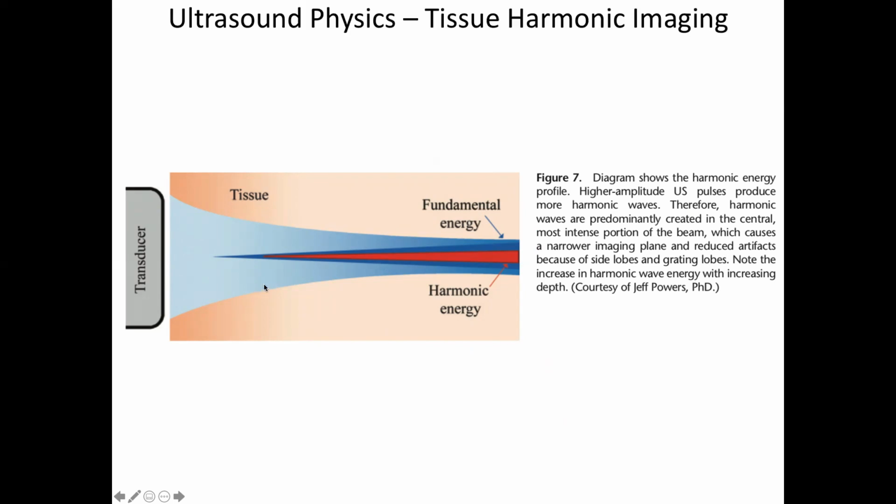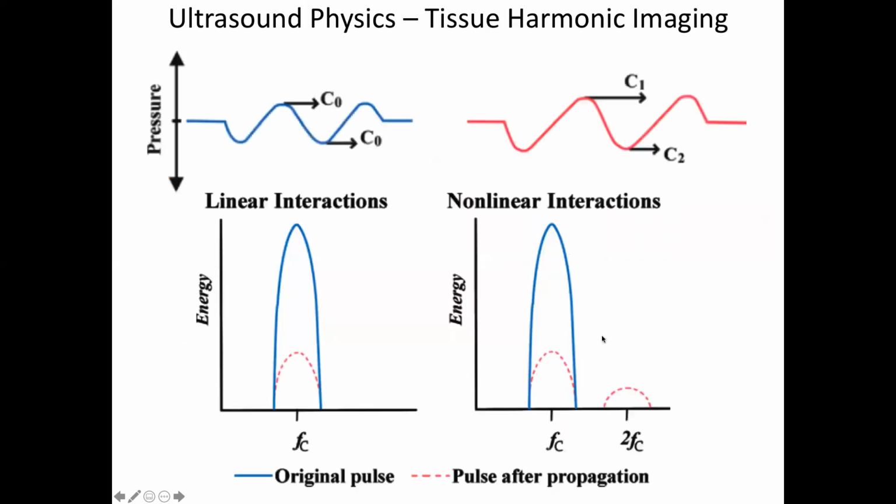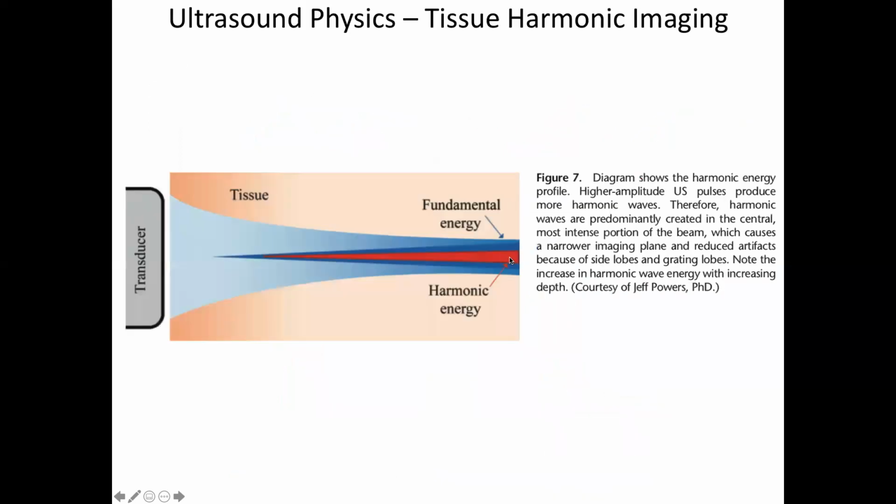And so this is going to help us in two ways, right? It's going to help us focus the beam at depth, and it's going to help the slice thickness become thinner at depth. If we just look at this signal, we know it's coming from this part of the sample and not out here. And so in both the lateral resolution and the slice direction, the whole thing is going to collapse down and be higher resolution, right?